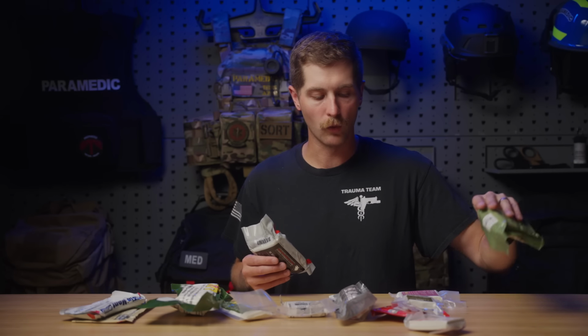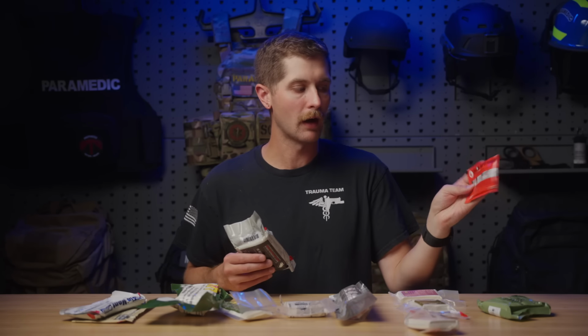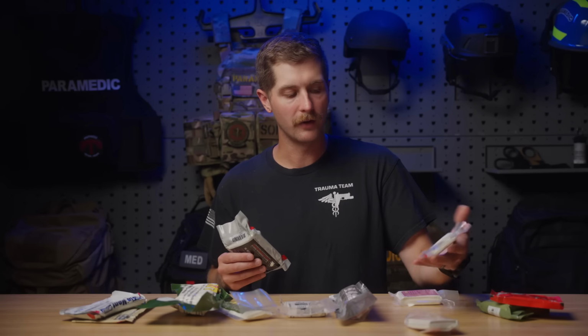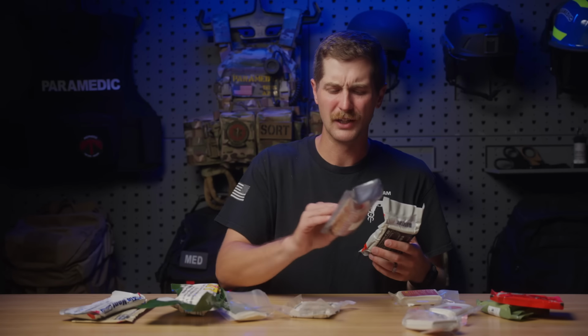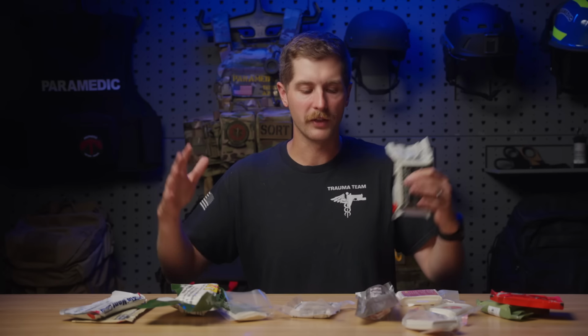I think this is important because while I would always recommend somebody buy two of everything before they put it in their first aid kit, this stuff's expensive. When we're talking QuikClot at $55 for one package of that Celox gauze, around the same price there, you have S-rolled gauze, which goes in and out of stock, it's hard to get. You have things like the battle wrap, which I think is like $15, $20. And so on and so forth. It gets very expensive, and especially for products that a lot of people are never going to use in their life, it's hard to justify having that extra cost just in the name of practice.